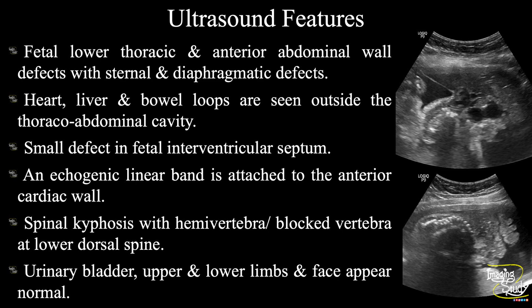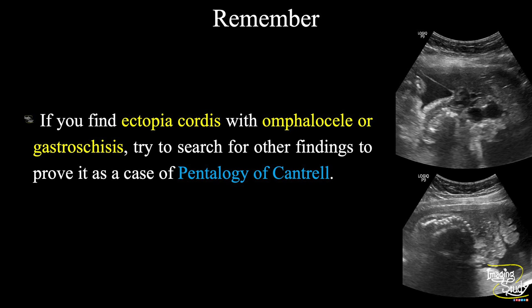In summary: fetal lower thoracic and anterior abdominal wall defects are seen along with sternal and diaphragmatic defects. The heart, liver, intestine, and kidneys are noted outside the abdomen — a combination of gastroschisis and ectopia cordis. A small ventricular septal defect is noted. An echogenic linear amniotic band is seen attached to the anterior margin of the fetal heart. Spinal kyphosis is seen with hemivertebra or blocked vertebra at the lower dorsal spine. Bladder, upper and lower limbs, and face appear normal. All these features suggest a case of pentalogy of Cantrell. The take-home message: if you find ectopia cordis with omphalocele or gastroschisis, search for other findings to confirm pentalogy of Cantrell.